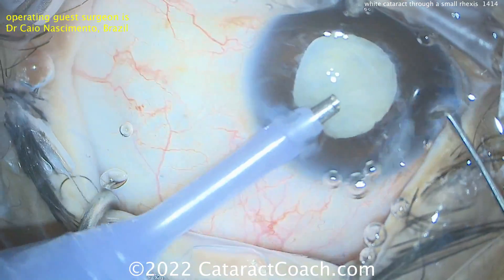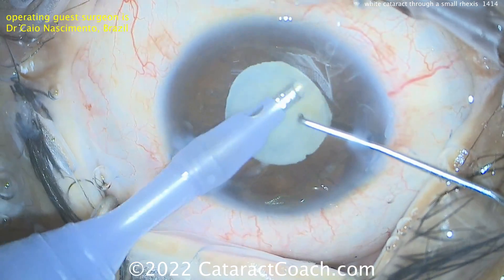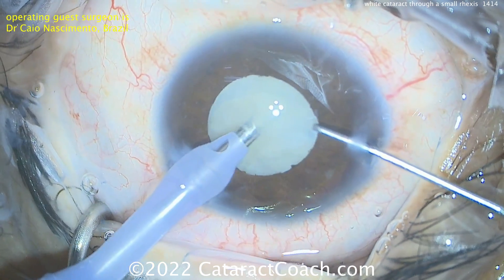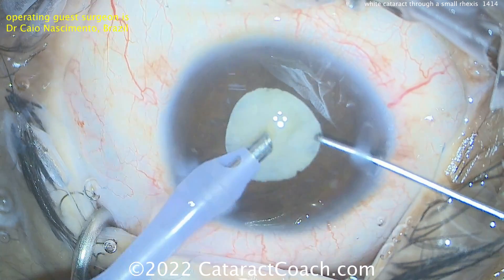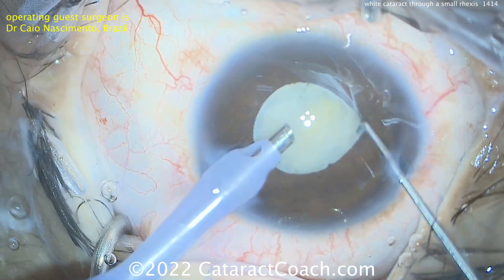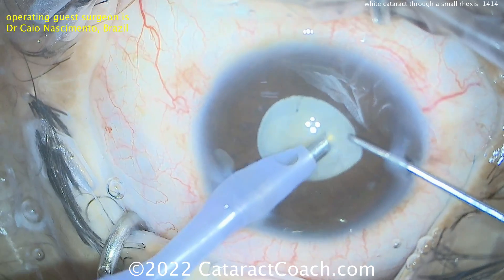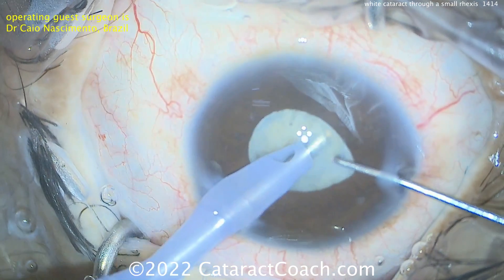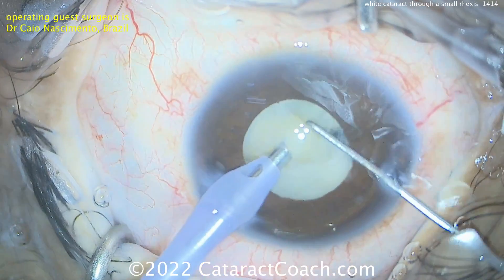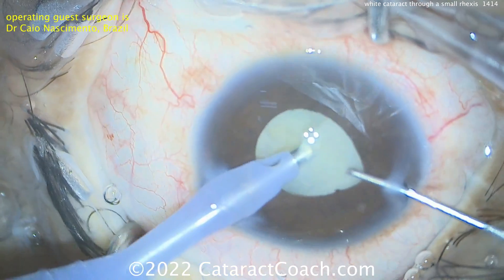So here's the phaco probe in the left hand. It looks like a chopper of some design in the right hand, aspirating out some of that lens material — especially that liquefied lens cortex, or some of the softer parts of the lens. Now buzzing over the phaco probe, going to get a good purchase. Maybe making a little bit of a pit there centrally, and that central pit can help to chop the nucleus. You can just tell by the motions — this is a very experienced surgeon with many thousands of cases. Look at that: tilting the nucleus up, nice chop technique, chop after chop, going to break that nucleus into smaller pieces. This effortless operation really gives away that this surgeon is very experienced.